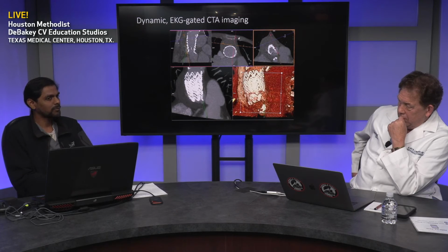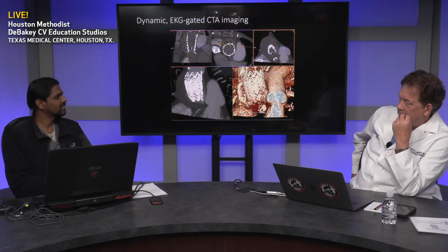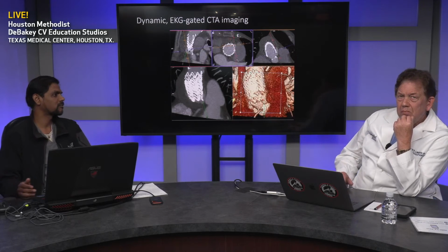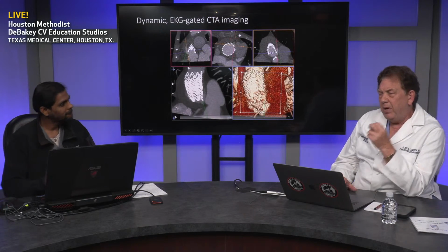What I would really consider suboptimal is, even after injecting 80 or 100 cc's of contrast, we still don't have the diagnosis, and the patient either ruptures or goes to the operating room for a diagnostic procedure. That to me is what we are trying to change here. So the simple way of thinking about this is that CT has got better spatial resolution.